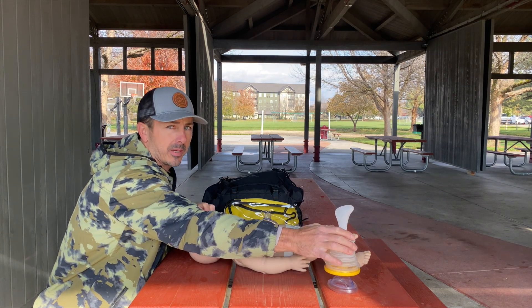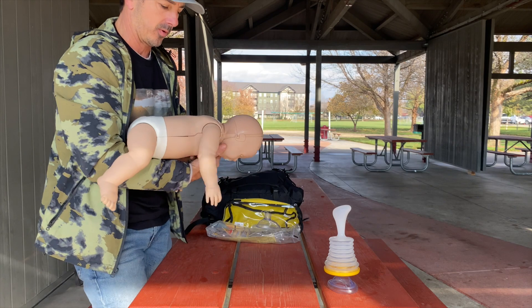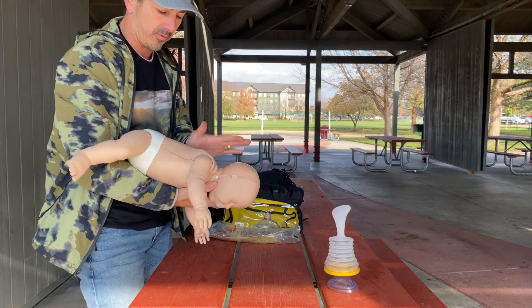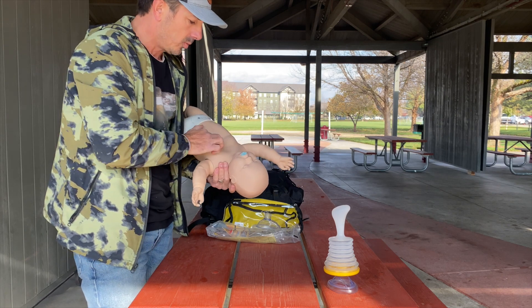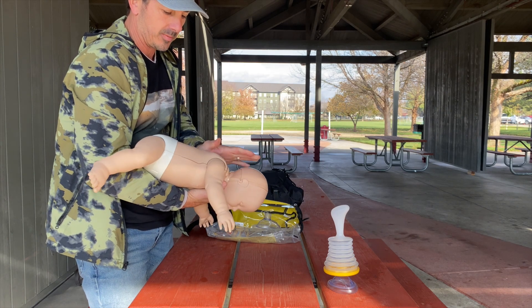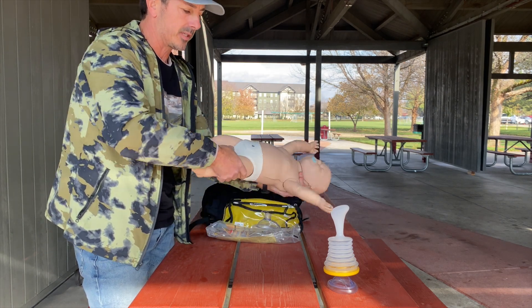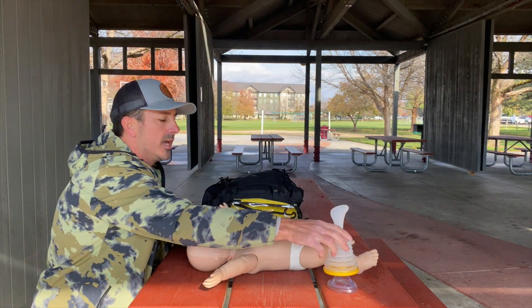Hypothetically, say we have a choking baby here at the park. We do our back blows and chest thrusts — the traditional choking response for a baby. That's your back blows: one, two, three, four, five, then turn the baby over, bring the arm in, one, two, three, four, five, then rotate the baby over. This is while the baby is still conscious.